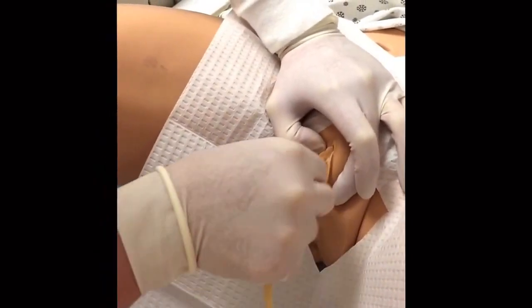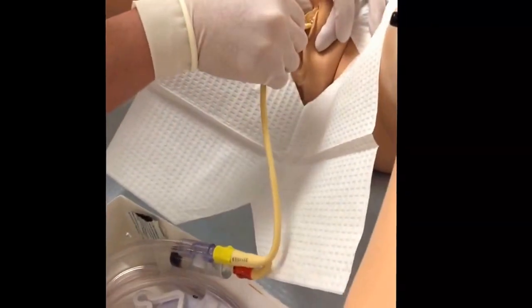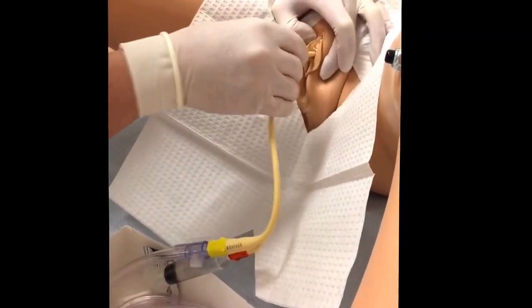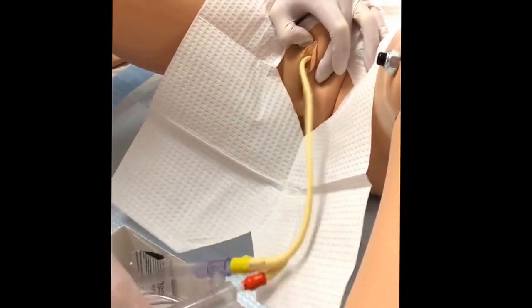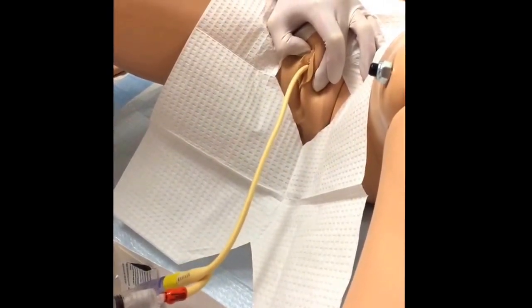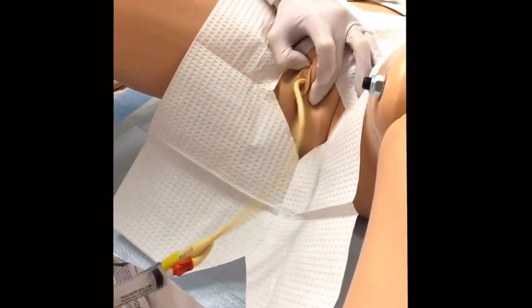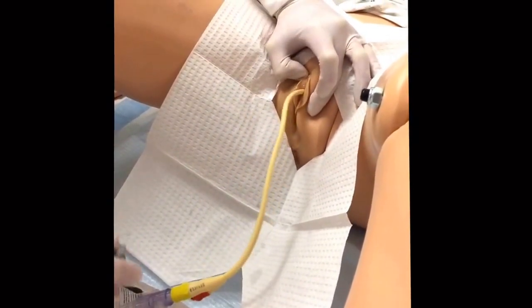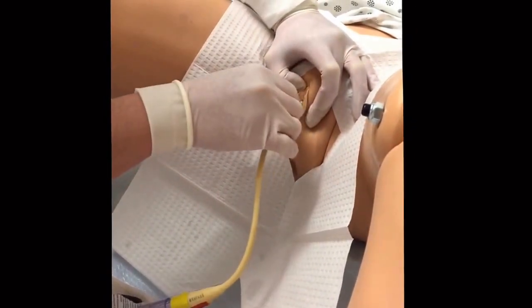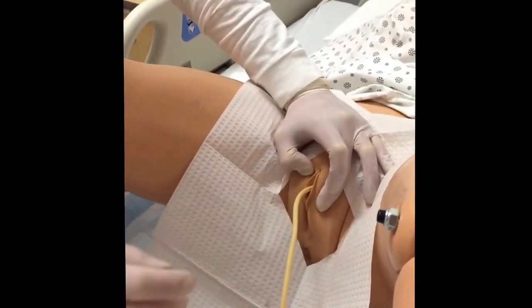And if you see the urine, you can go in for 2 more inches to make sure that the balloon is inside, and you can inflate it. And now you can go ahead and put water in the balloon. Let me know if you're feeling any pain, okay? So that's good. Make sure the balloon's inside. So that's good. Thank you.